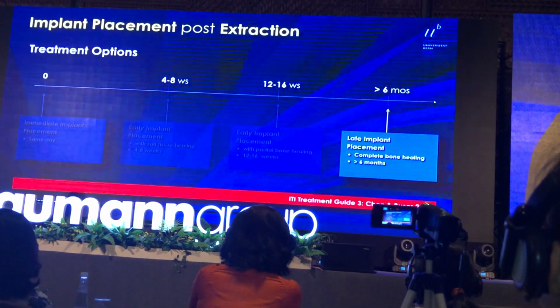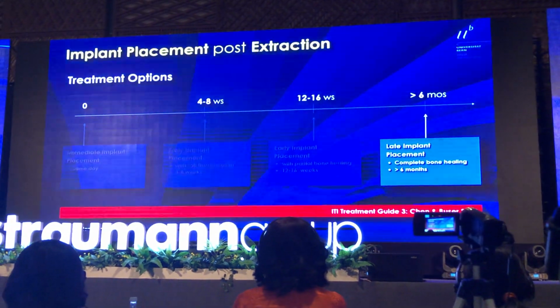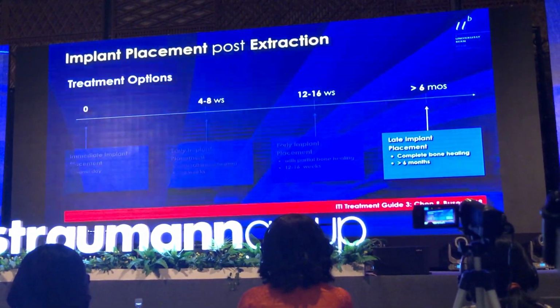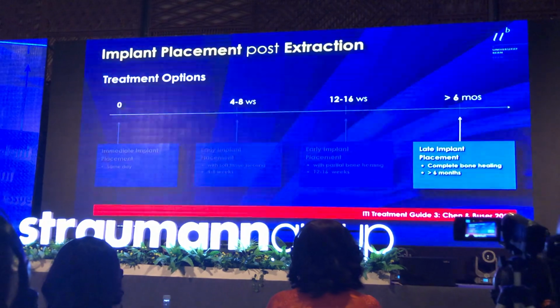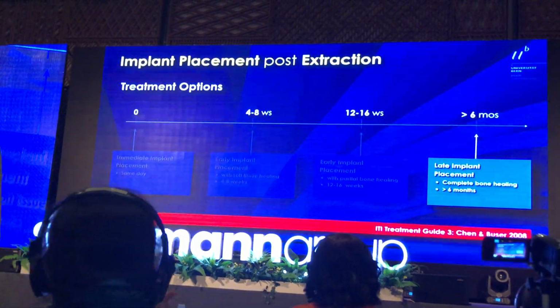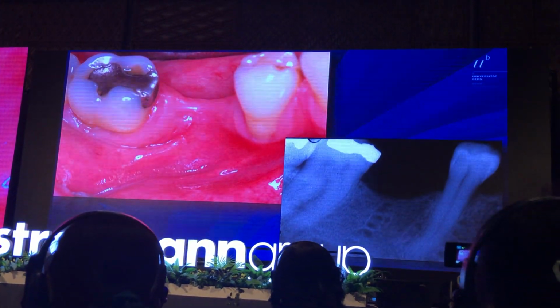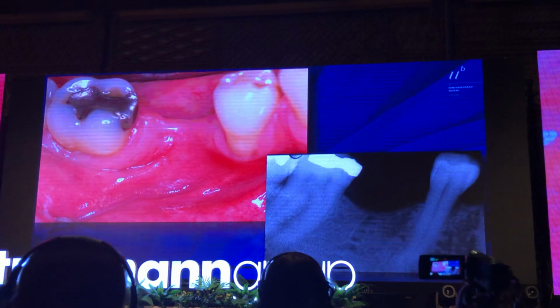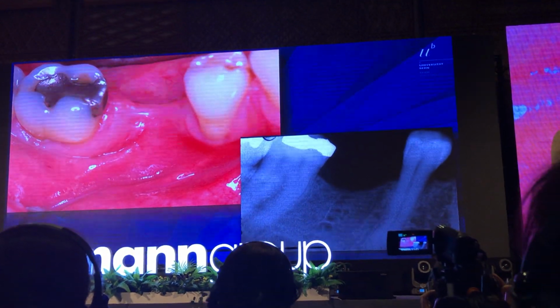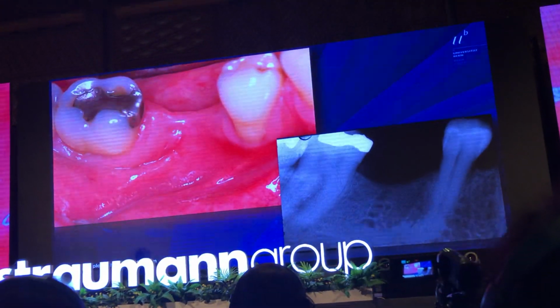Okay, now late placement. Late placement is done when an implant patient comes in and had an extraction 5 years ago. Then he's fully atrophic. And that's a case I want to show you. He's a veterinary doctor. I know him very well because when I was a student, he was in the medical school, but he became a veterinary doctor then.